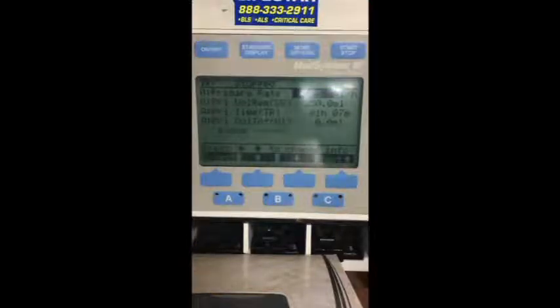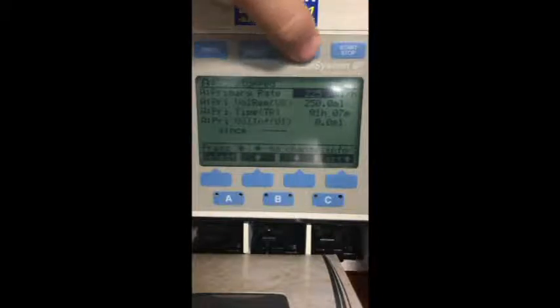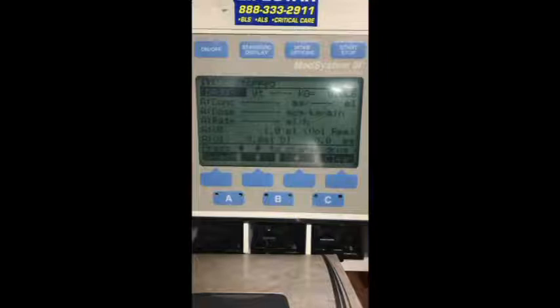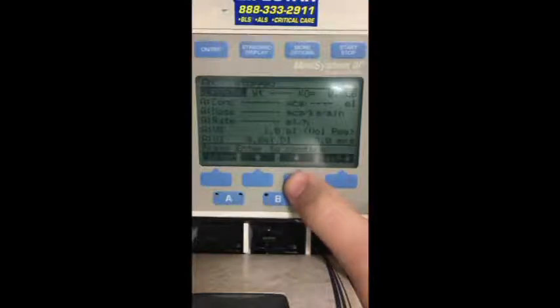If we were setting up a calculated drip, such as a nitro drip, we would go to more options while in a channel, and then you can see calc on. Calc on switches it to the drug mode, and we can choose no drug. This is whatever drug we want it to be. We just hit select and move over. If we go down, you can see that there are a bunch of meds already put into place, like amiodarone.